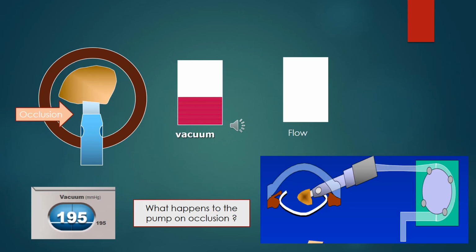So in this slide, what you see is that the nucleus piece is blocking the phaco port. And in the world of phacoemulsification, we call it occlusion. As it occludes, the pump is still rotating, right? You can see at the far down at the right side, the pump will still rotate in the picture over here in the green color. The pump will still rotate, but the phaco tip is blocked, so there's no fluid now.